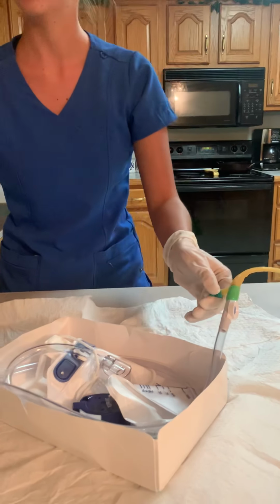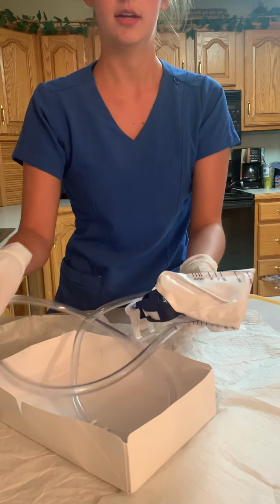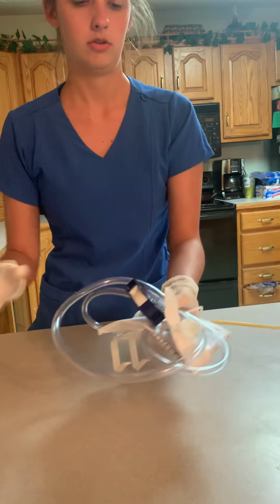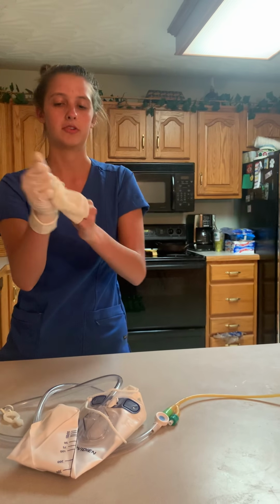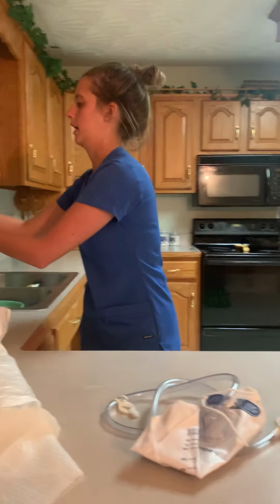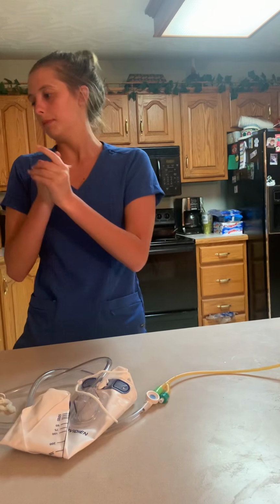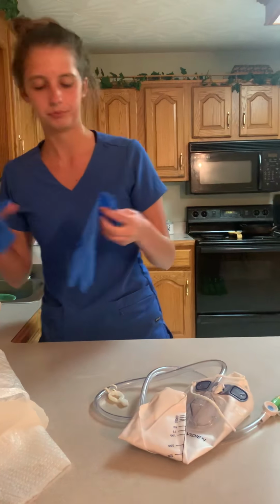I'm going to go out and away. And then we can take this and remove all of our garbage to the end of the bed. We can lay this on the bed now. I'm now going to remove my sterile gloves, and I'm going to wash my hands. And I'm now going to put on a clean pair of gloves.